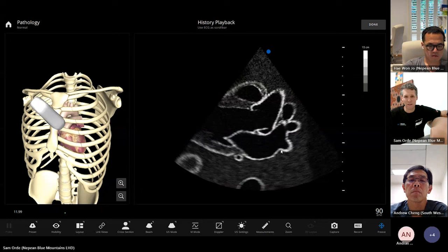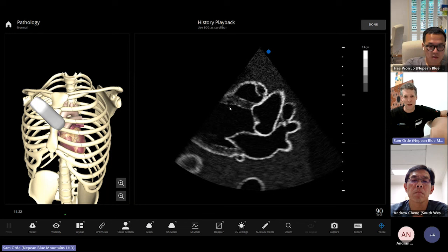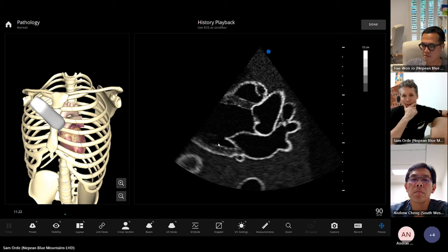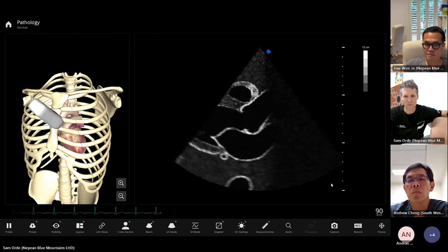I move backwards and forwards looking for the largest area — where the mitral valve is filling the left ventricle, and then just where they close. I measure perpendicular to the left ventricle axis across the internal diameter. If the internal diameter is bigger than 58mm in males and 52–53mm in females, that's when you're starting to get into the mildly dilated phase. You can then carry on scrolling through to just before end systole — when it's at its narrowest state, just before the mitral valve opens — and measure again to get end diastolic and end systolic cavity size.